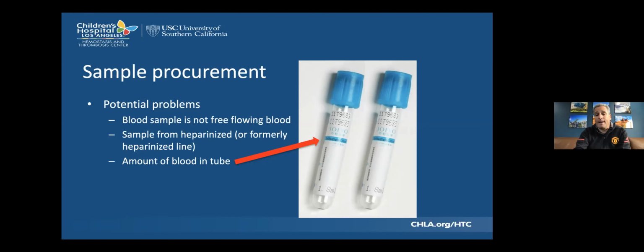Your hospital may not carry them. They're a little bit harder to find. But if you're working in a NICU or a pediatric ICU where you've got smaller patients, you should ask your hospital to stock those tubes.